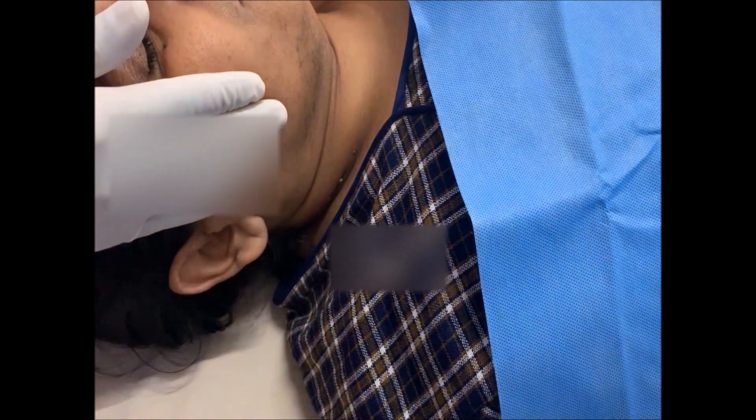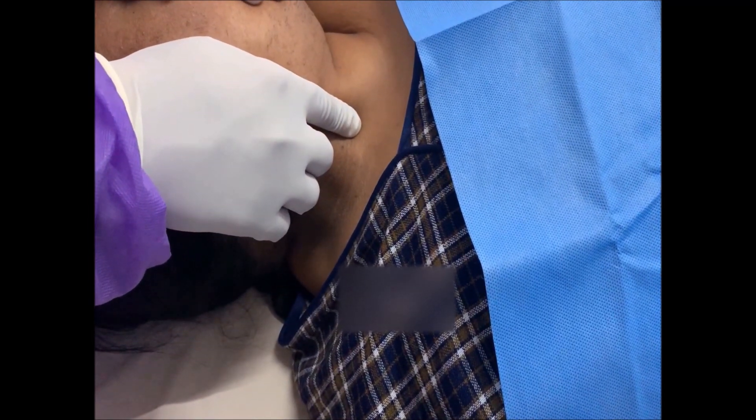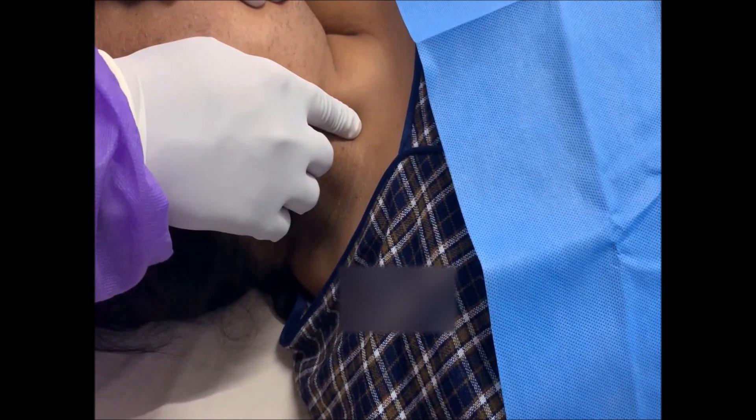Once all the equipment has been arranged, place the patient in Trendelenburg position not more than 15 degrees. This decreases the risk of air embolism and also engorges the vein. Turn the head to the opposite side. Locate the internal jugular vein at the apex of the triangle formed by the sternal and clavicular heads of sternocleidomastoid — it is located just lateral to the internal carotid artery.